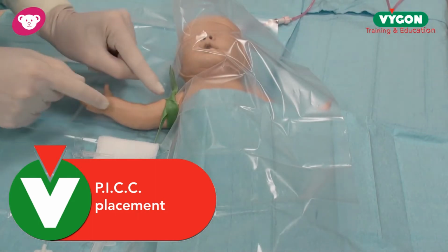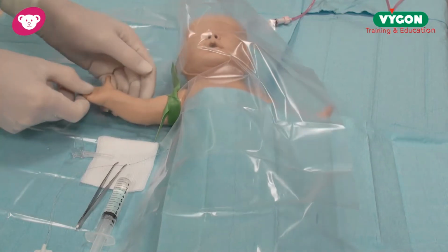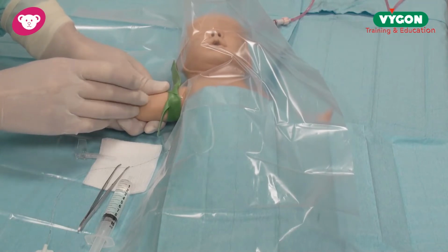I've now applied the tourniquet. I've found the chosen vein. This is the basilic vein. I now hold the baby's arm to restrain the baby, and just to double check, that's the chosen vein.